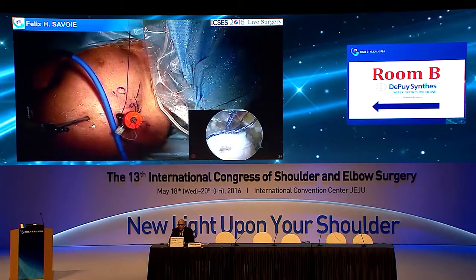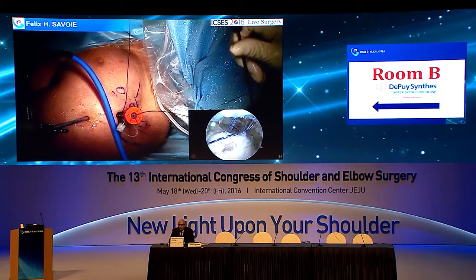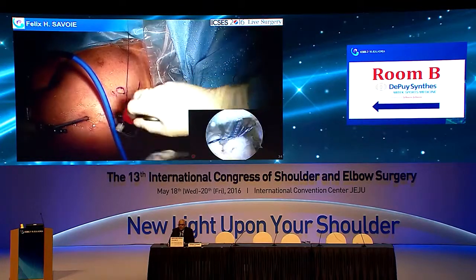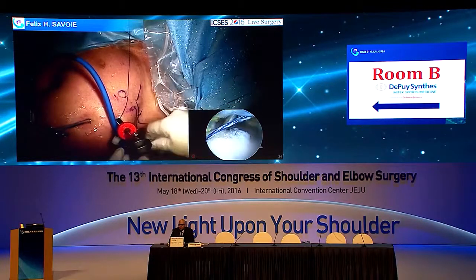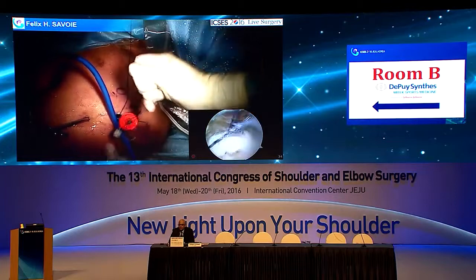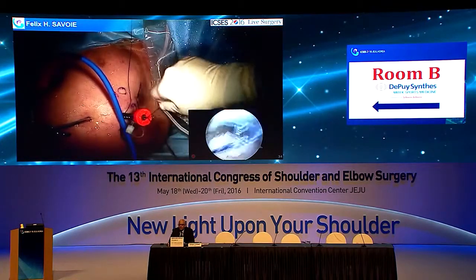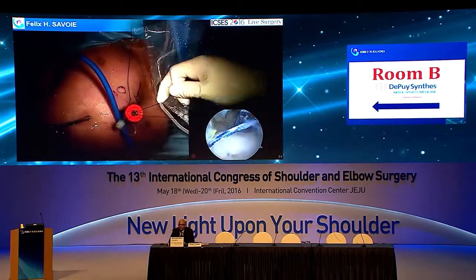So if we back up a little bit, you can see how now you can't see the joint anymore already, but we have that delamination of the infraspinatus that we'd like to close. So see how it moves it over? So you know we release that coracohumeral, which gives us tons of length. And so now this is going to really lay down nicely. And the question will be, she's got a very small tuberosity, so you really can't put a bunch of anchors in my opinion.